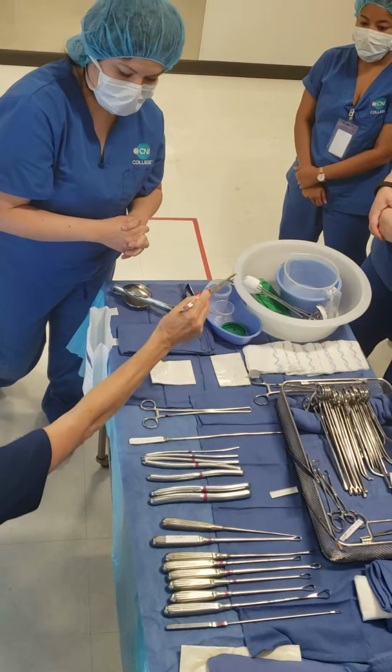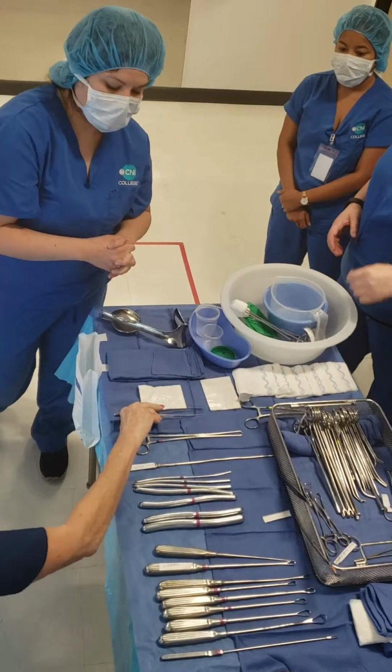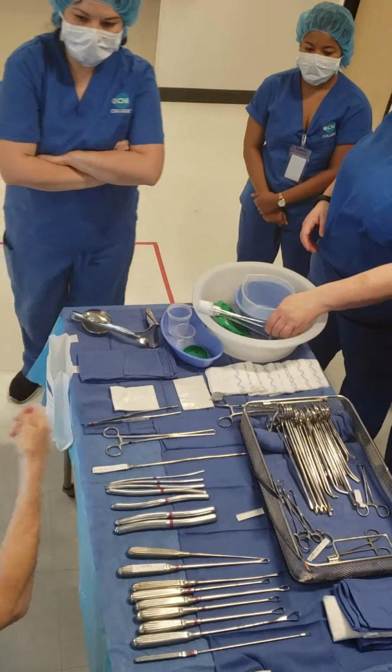So then you're going to get these tips wet, and you're gonna pick this up and put it in the specimen cup. Okay? Usually a spoon will do that.